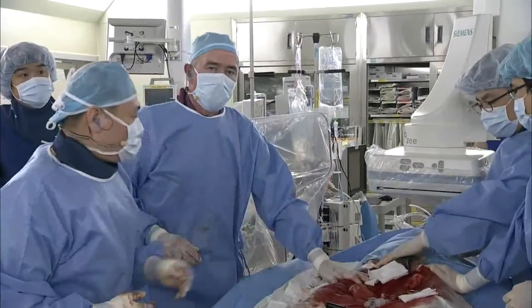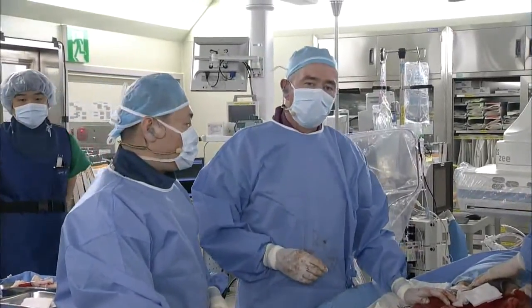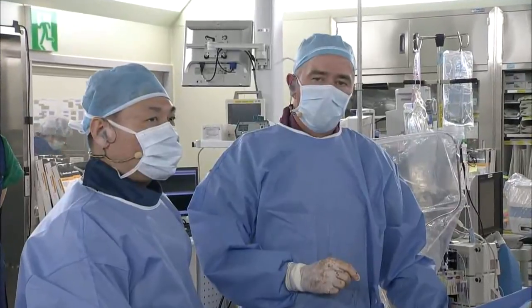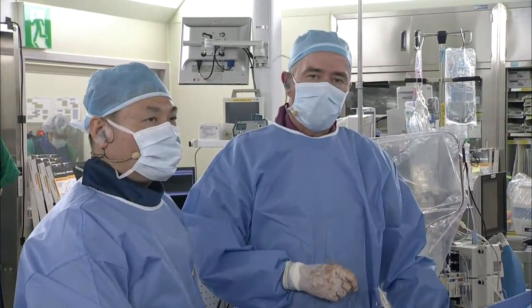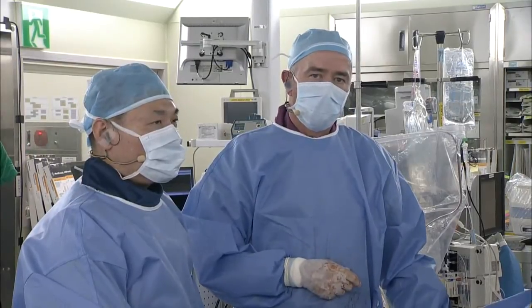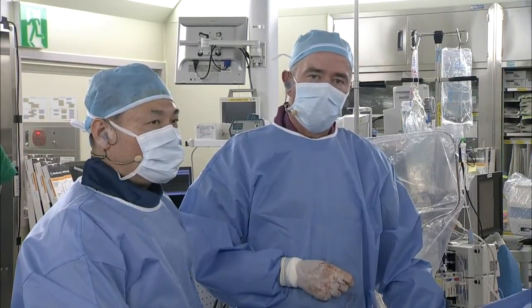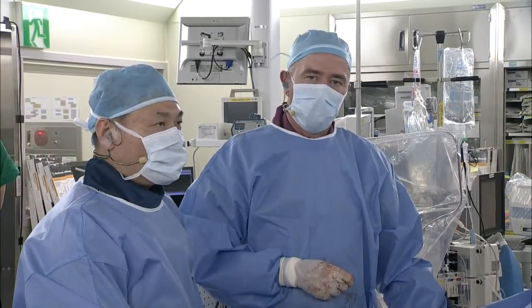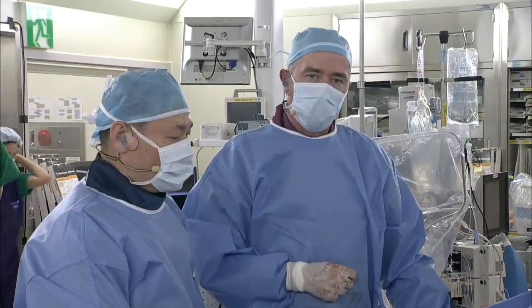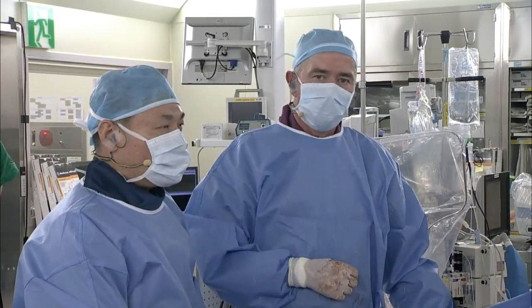I think it was a challenging case on a lot of fronts, with the reverse taper of the infrarenal neck and also the short ectatic right common iliac artery requiring us to cross the internal and embolize it ahead of time, and then the short left common iliac where we ended up with a type 1B endoleak that was successfully managed with just a tiny little bit of an extension there at the end and done totally percutaneous.